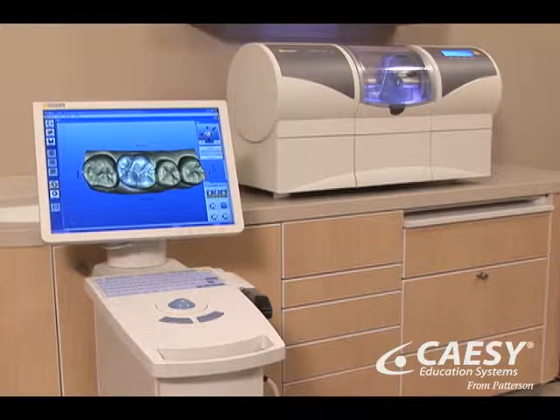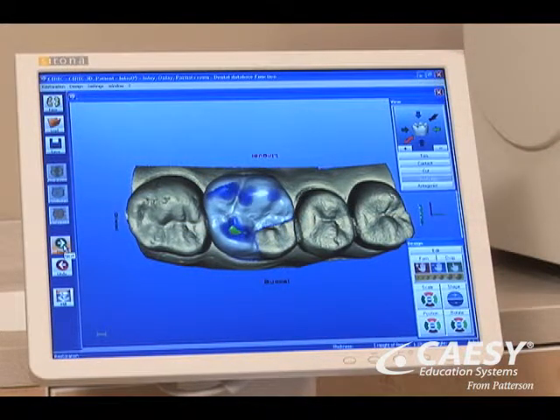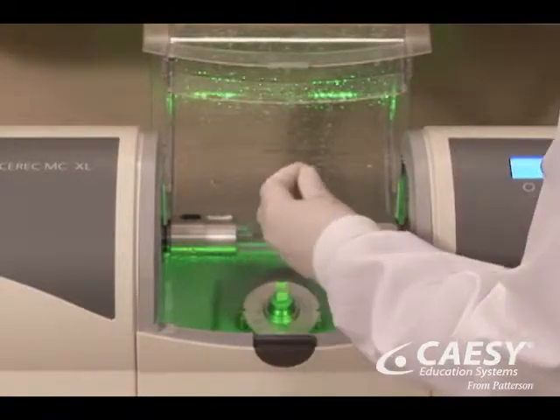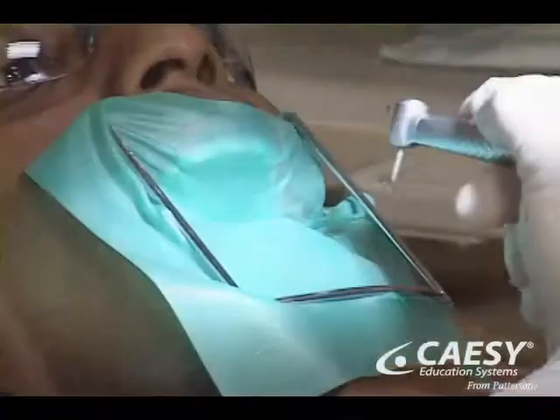This is CEREC, a powerful computer-aided design and manufacturing technology in dentistry. This CAD-CAM technology allows us to custom fabricate tooth-colored restorations — crowns, onlays, and veneers — right here in our office and all in a single appointment.